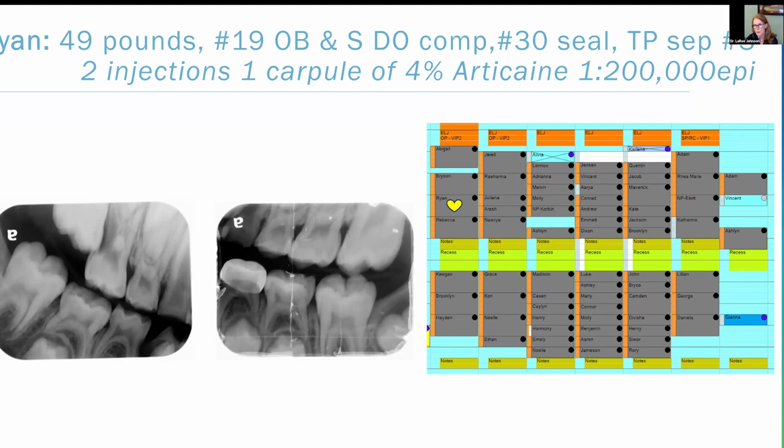So also, by the way, we put a TP sep right here to get tooth 3 to jump. And I always do a little dot. So for example, I just basically do the blanching mucosal step right there to get the TP separator in there to institute the jump, bring them back in 3 weeks, take that out, put an elastomeric in there, and then deal with it from there.